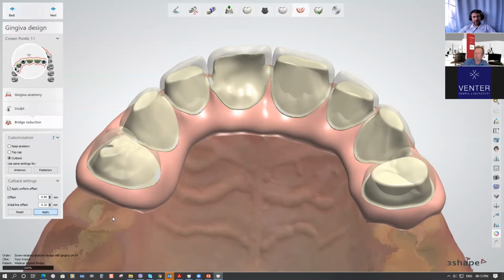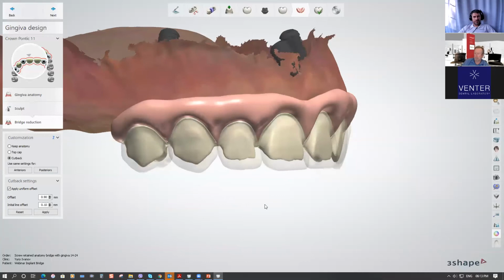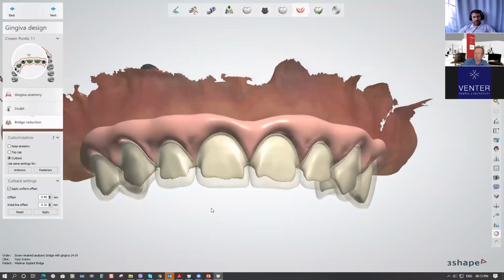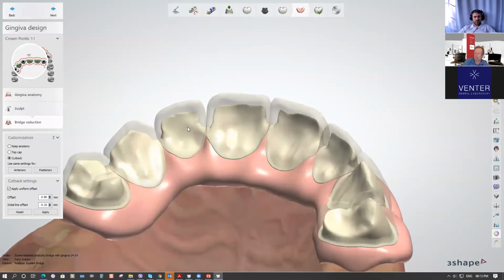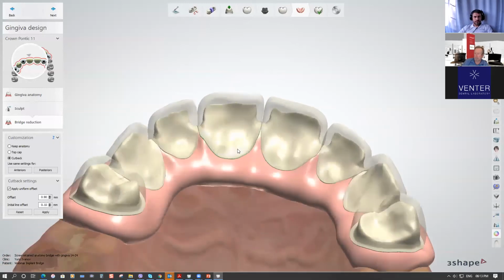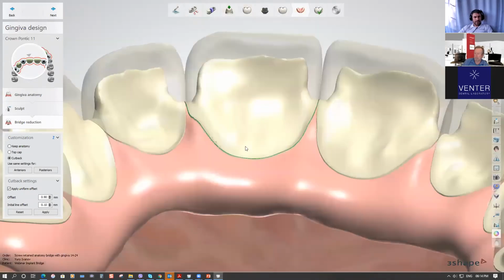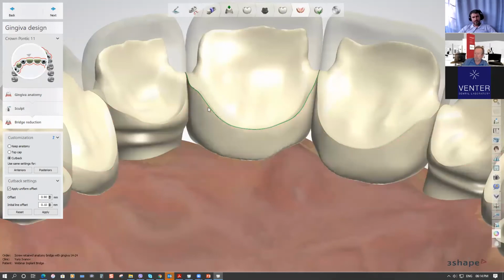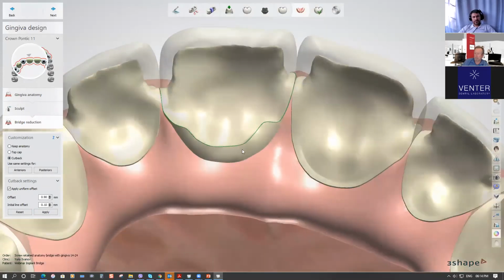You could combine it with any groups of teeth, or even tooth by tooth. And I like this cutback because it's ready for veneering. It looks like this, and on the next step, if I need, I could morph using the morph. I could sculpt over the design. And you could see we have this spline as a margin line, and in case I need to replace it, I could just draw it a bit more, like making some kind of lingual band like this, and hit apply. In this case, I will have an uncovered area over this tooth.